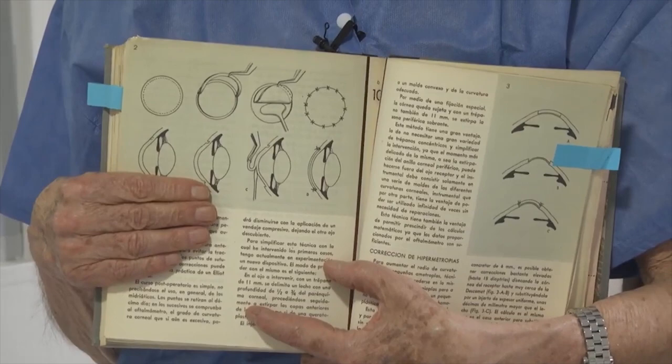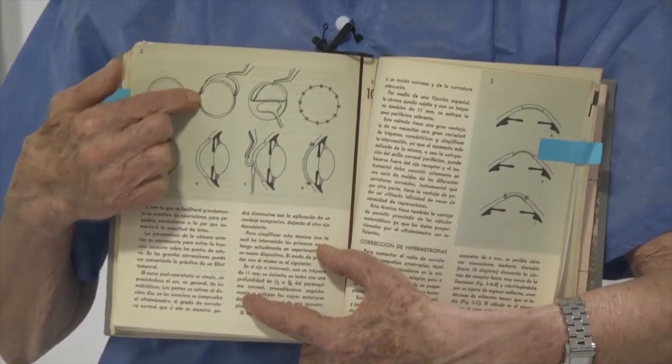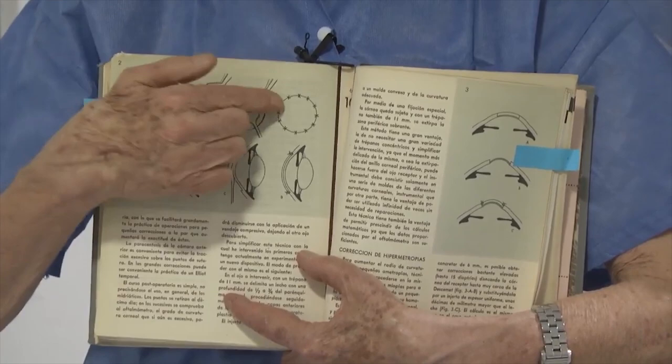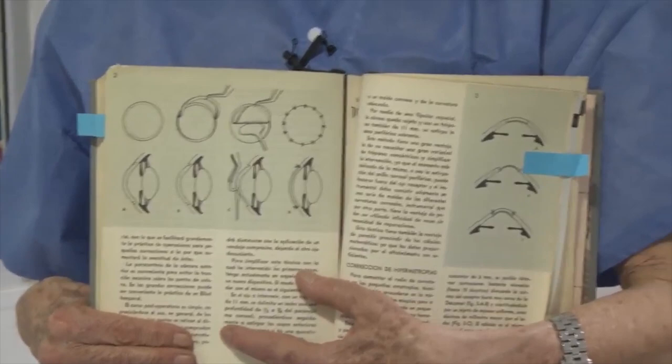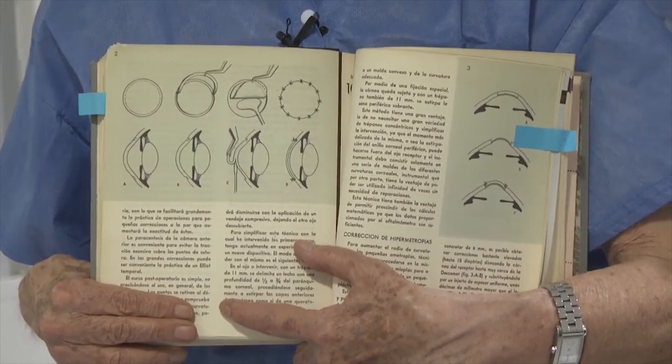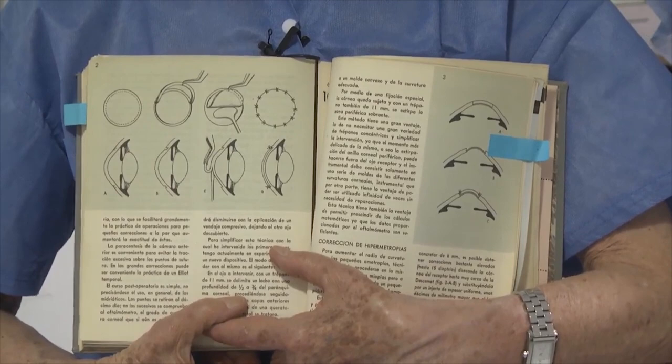He made a circular resection of tissue of 11 millimeters diameter, then dissected the anterior layers of the cornea, and afterwards sutured back again those layers. Now, Dr. Carriazo has modified this technique using the new technology we have nowadays, and I'm going to leave him with you to explain exactly what he is thinking and how he is doing this new technique that is being called remodeling of the cornea in keratoconus. Thank you.